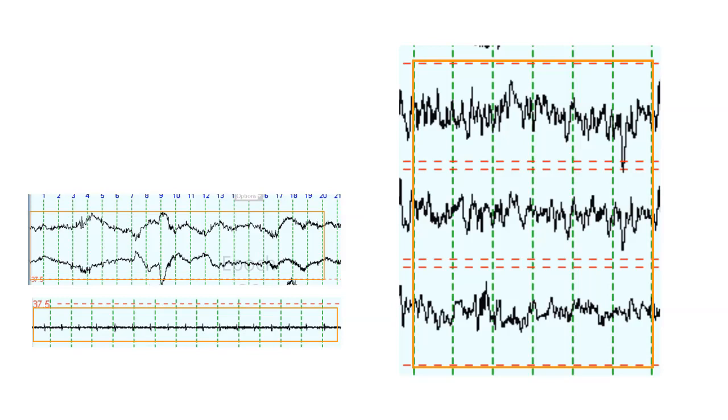Okay, so here I have a closer view of your eyes, and again, you can just see those rapid eye movements. Again, your chin is very quiet. There's nothing to count on those, it's just recognizing it and identifying it.